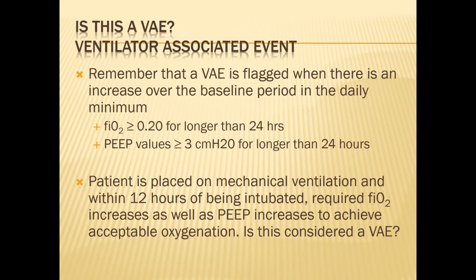Have you come across this where you're wondering, why aren't they weaning the FiO2? Why aren't they weaning the PEEP? Yeah, so on 40%, if you have a PaO2 of, I'm picking a high number, like 150, you say, oh my God, they don't need to be on 40%. Let's turn that down. But if something happens and they need more oxygen and you have to turn it up, now that becomes a flag for a ventilator associated event. And when hospitals have too many ventilator associated events, I don't know if it affects their reimbursement from insurance companies, but it's a big deal.